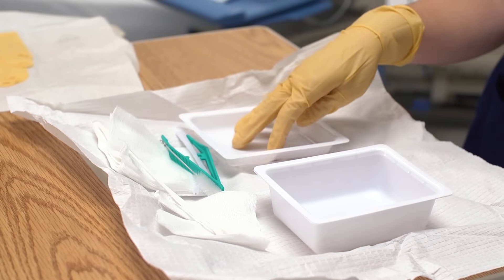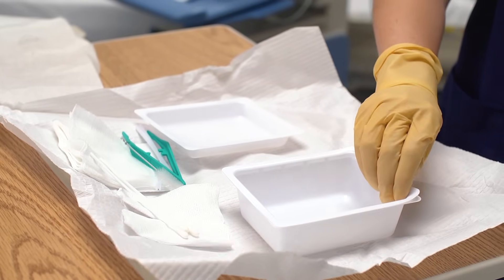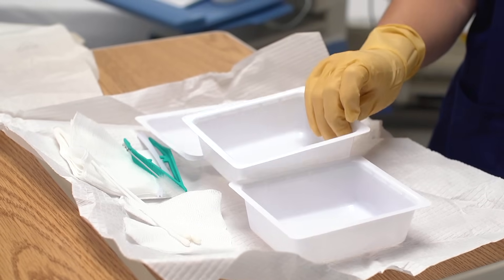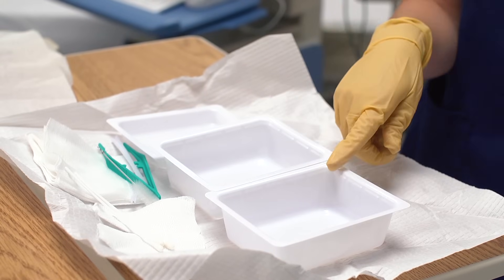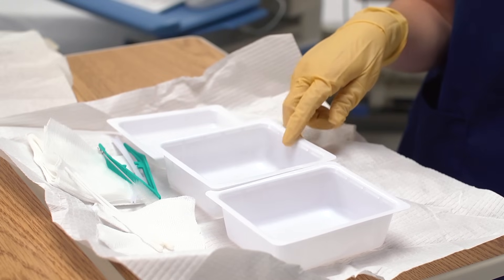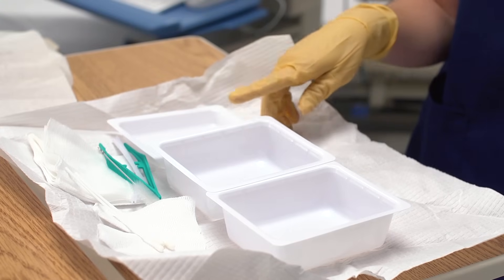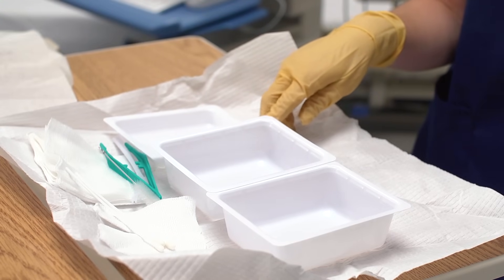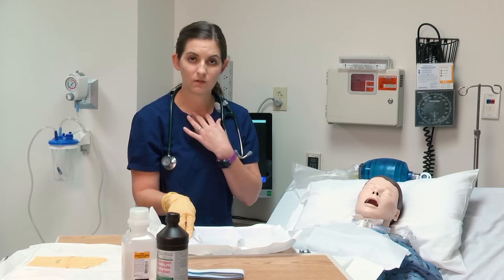There are three containers. In the first container we're going to pour the hydrogen peroxide. The second container will be the sterile normal saline for rinsing. And the third container will have sterile normal saline to clean around the stoma and on the face of the trach.